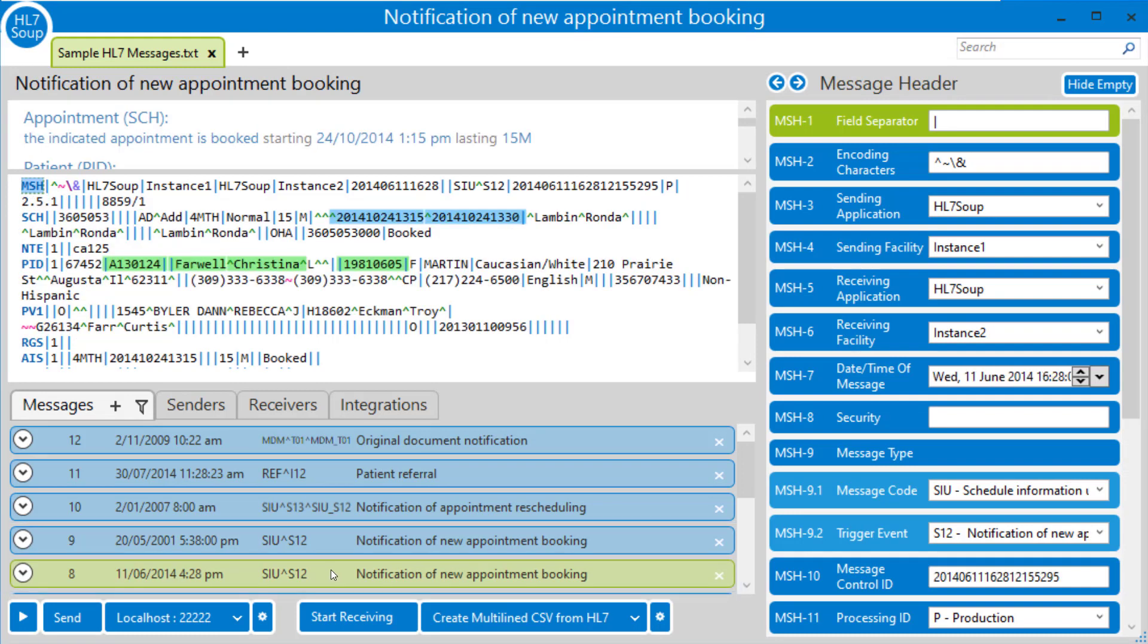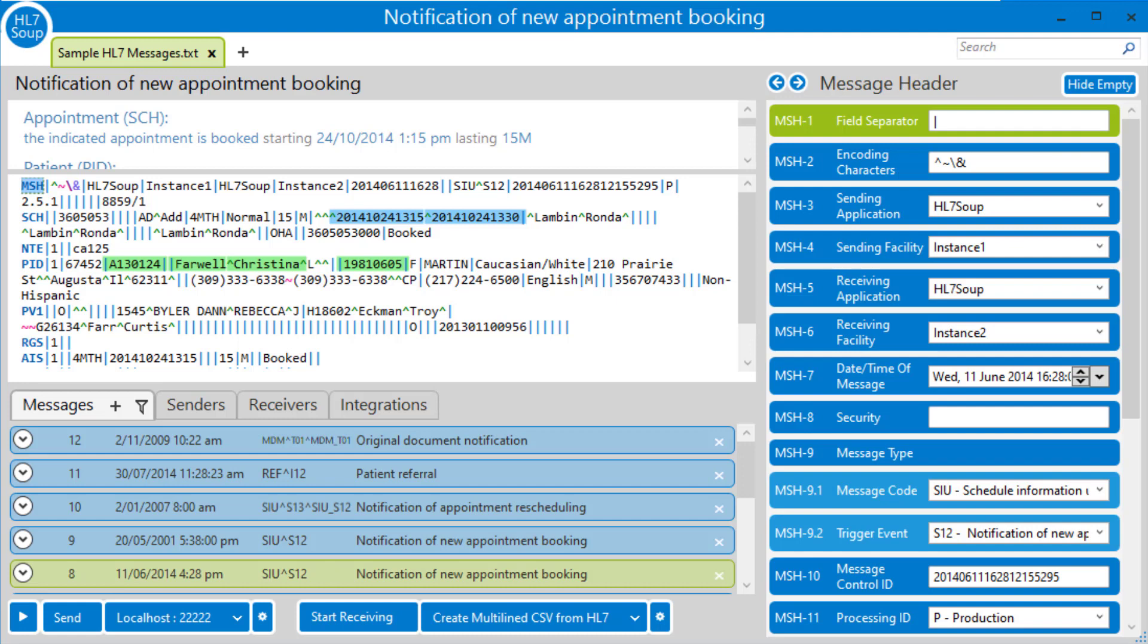So for this example, we're going to extract the patient's ID, their surname, their first name, their date of birth. And then later on, we're going to create an appointment for that patient. And for the appointment's dates, we're going to be using the SCH 11.4 and 11.5 for our data.